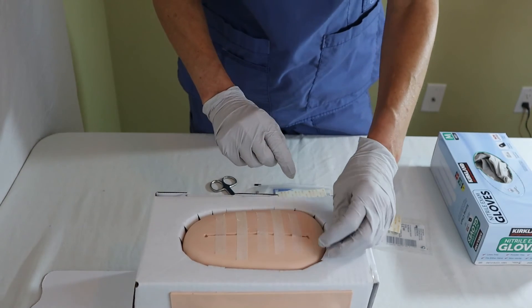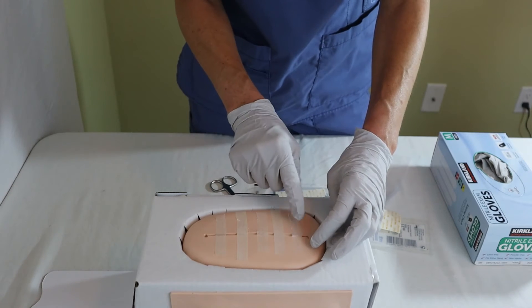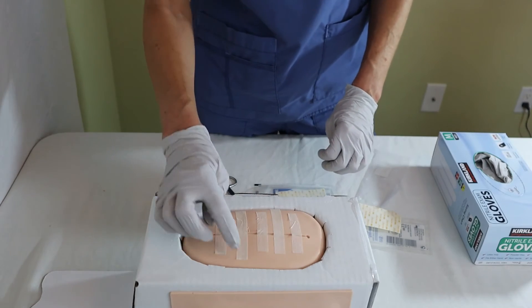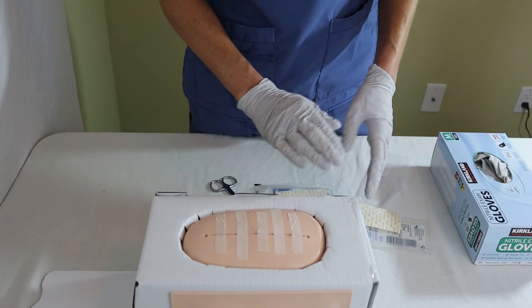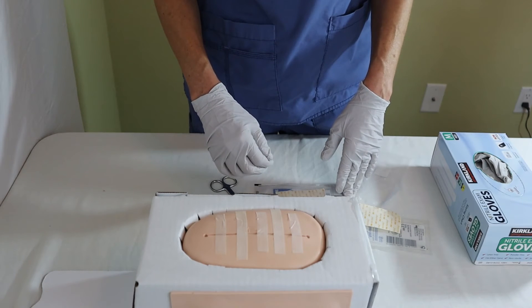You can see there's now a little bit more space between the strips because I've been able to close the wound with the SteriStrips. This will be fine. Then depending on the orders, we can either cover this wound or just leave it open to air.